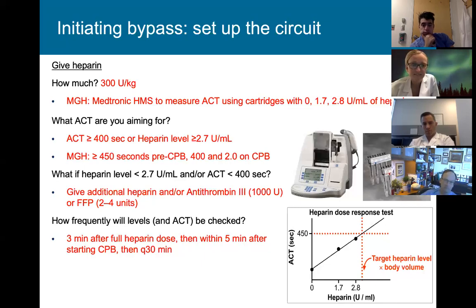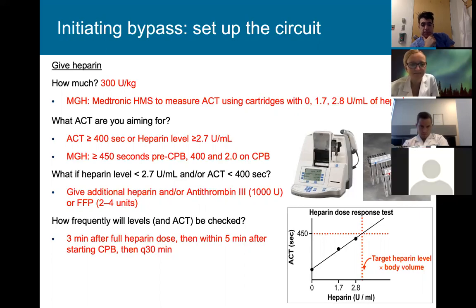You have to think of them because some old-time surgeons actually used to give heparin themselves into the right atrial appendage for exactly that reason. Nice. Also, you should pay attention to the number this machine gives and what they're planning on giving. It should always be around 300 per kilo. Sometimes it's wildly higher or wildly lower, and in those cases I tend to overrule it and meet somewhere in the middle, because the machine is not that good, in my opinion.